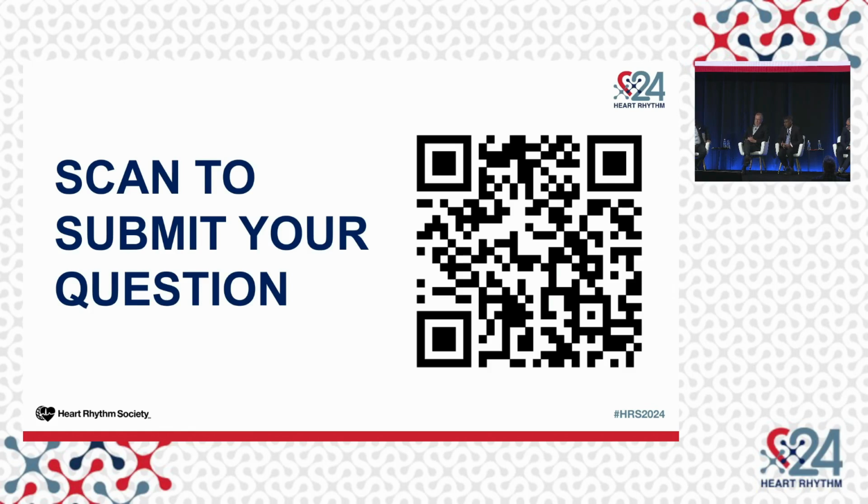Yeah, absolutely. I think if you exclude the blood by using a balloon, all the electrodes that are stuck between the balloon and the tissue are essentially not going to cause any hemolysis. On the back end, if you have some of the electrodes sticking out, a small portion of that will create hemolysis. So I think this sort of design would technically eliminate the possibility of clinically relevant hemolysis in a case. Thank you. And David, one question that came up from the audience.